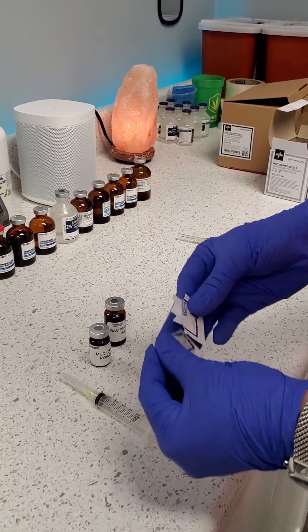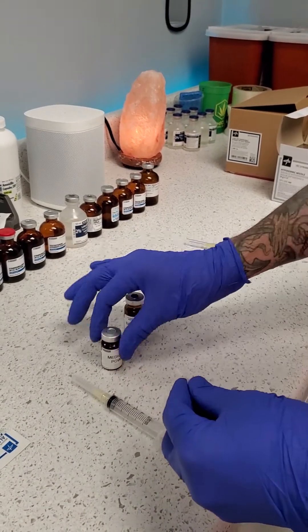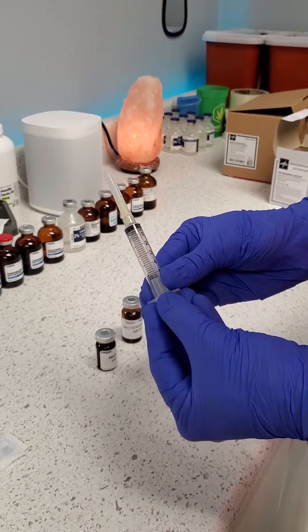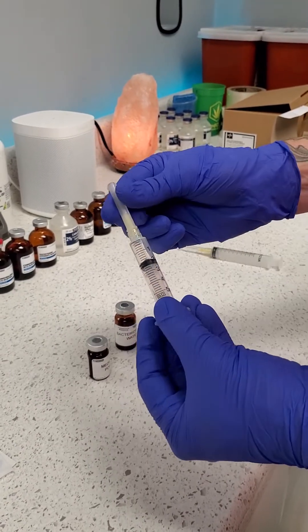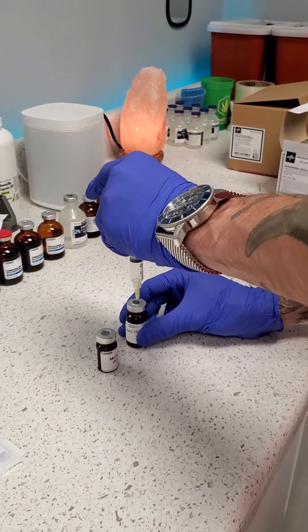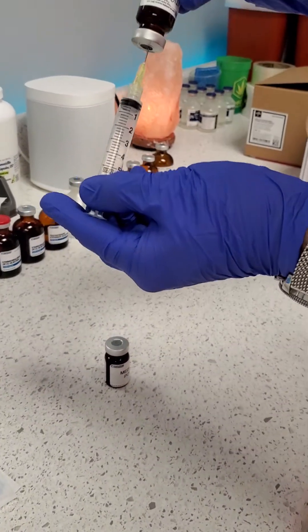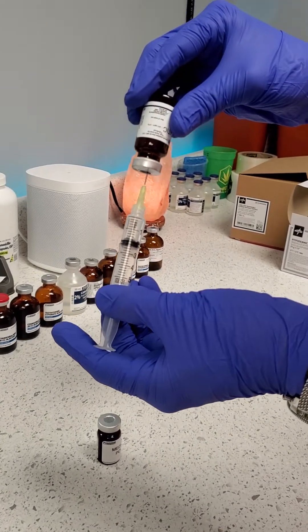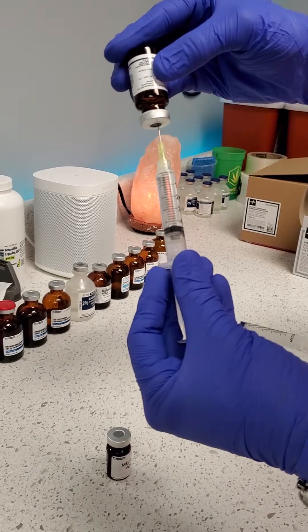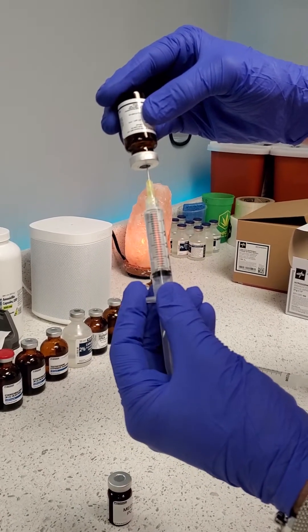Step one: open your alcohol pad and wipe the top of your bacteriostatic water vial, then do the same to your powdered medication vial. Then draw just one or two milliliters of air into your syringe and remove the cap on your needle. Insert the needle into the bacteriostatic water vial, push the air in, then flip it upside down and release the pressure. You'll see the liquid pushing right into the syringe because it's a vacuum-sealed device — the vacuum draws the liquid in, making this a little bit easier.